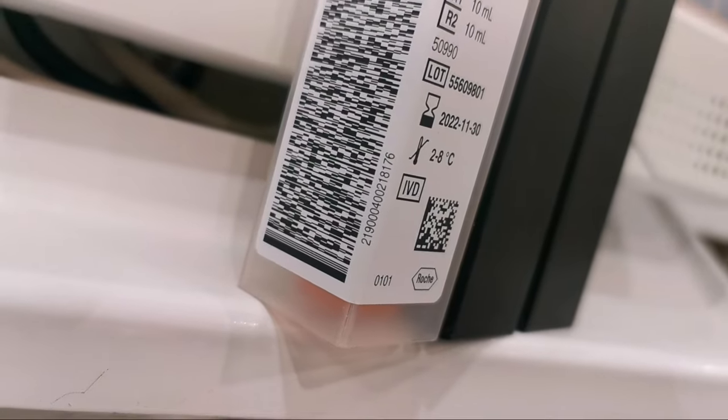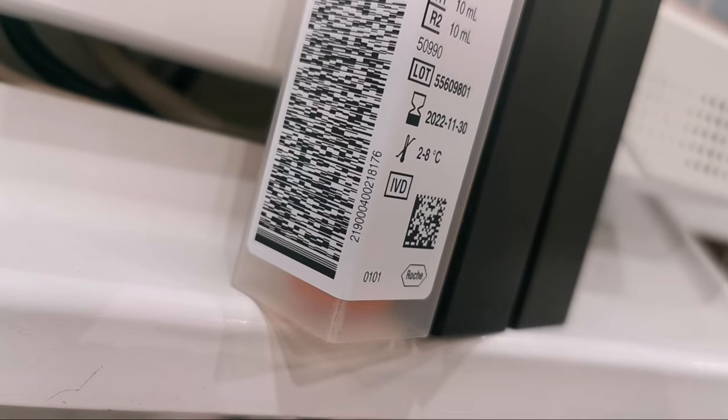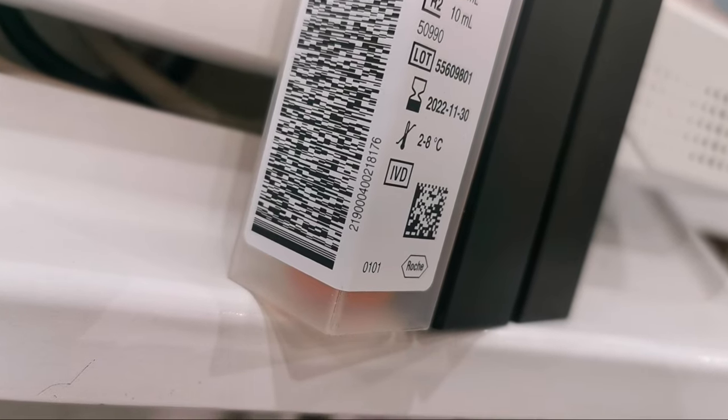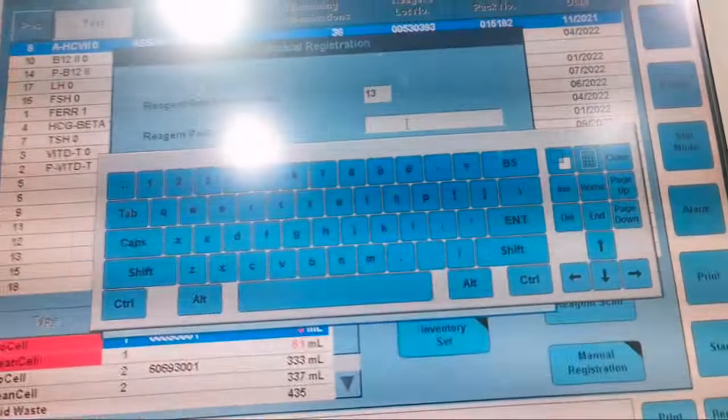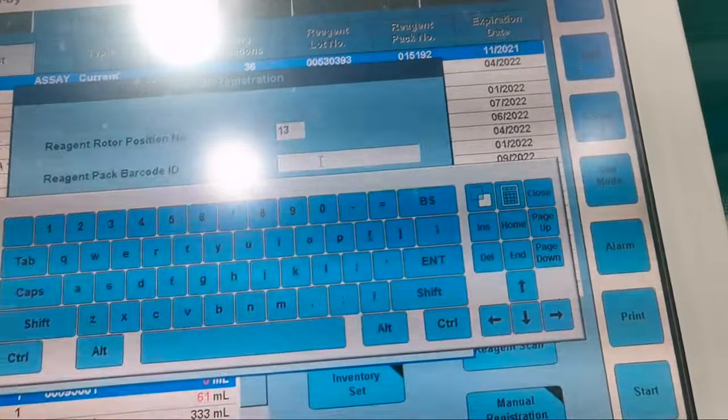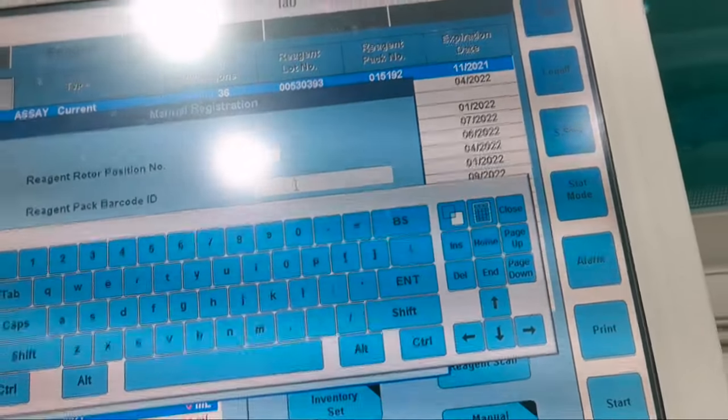This is the Reagent Pack Barcode. Now we will put the Reagent Pack Barcode ID.